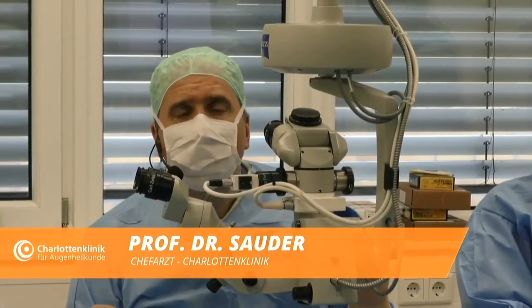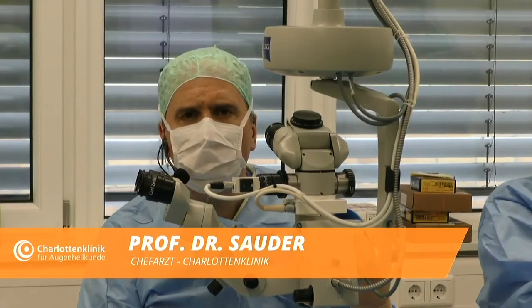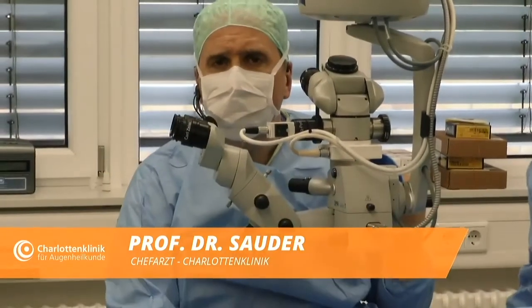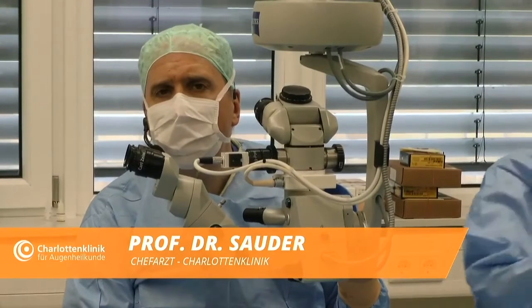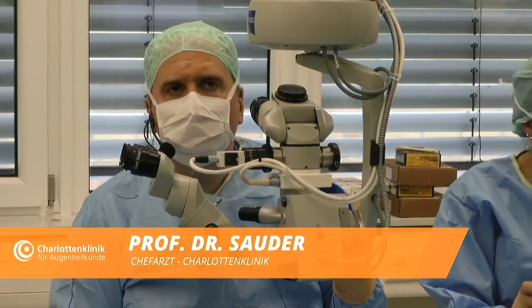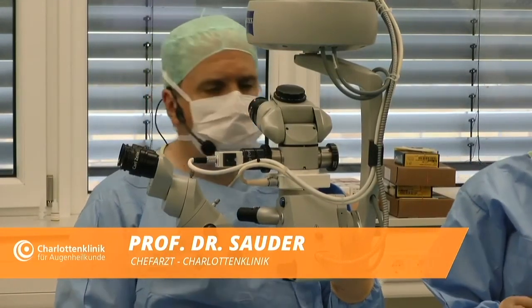I had one case of a patient with this situation, one or two. In one patient I was able to implant it, in the other not. And I was only able to decide it during the surgery, but I told the patient that it is probably going to go well or not. Because the amount of Soemmering cells was so big that there was no space for a safe implantation of the IOL in the ciliary sulcus.